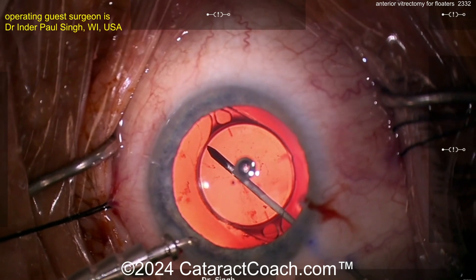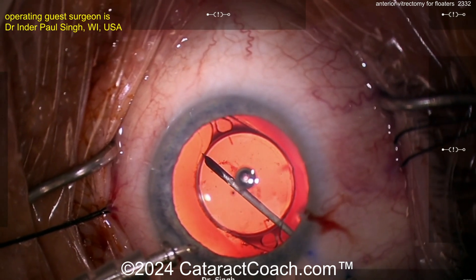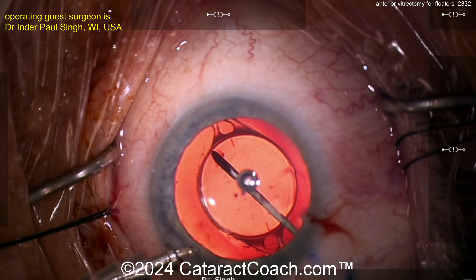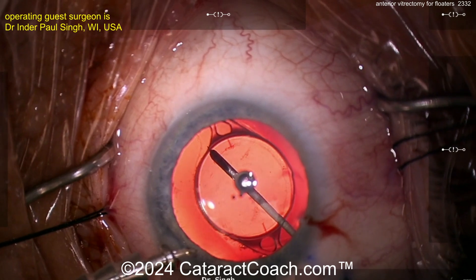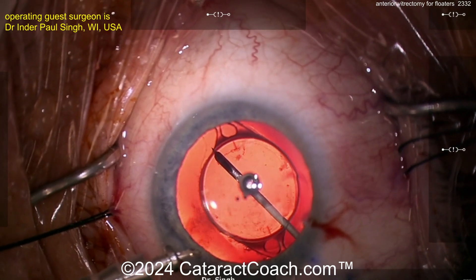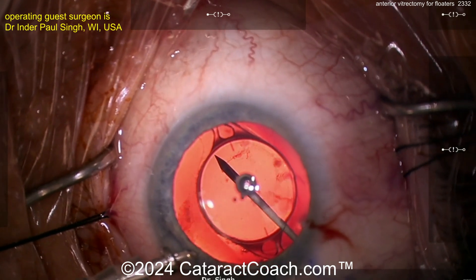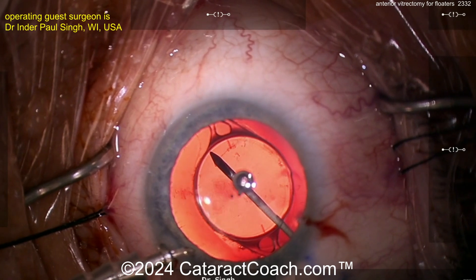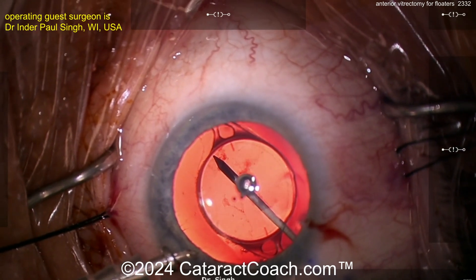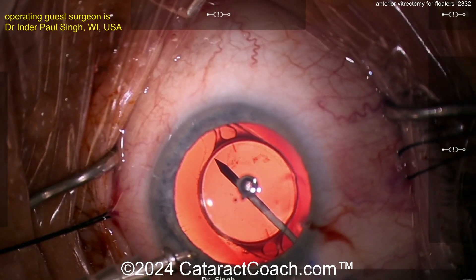When I start to turn the vitrector on and press the pedal, you're going to see all these particles just come towards the tip. I keep the vacuum low — around 150 or so, less than 200. You don't need a lot of vacuum because these are all liquefied vitreous opacities, so they go to the tip with very little vacuum. Using less vacuum causes less of the attached vitreous from the retina to want to come towards the tip. Staying here without moving the tip, letting things come to you — cutting about 5,000 cuts per minute.